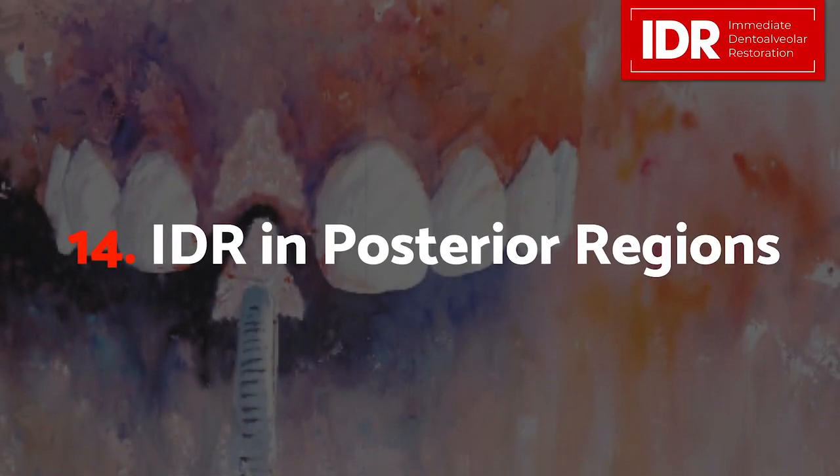Module 14, IDR in Posterior Regions. Here in this module, I will share with you the IDR application in the posterior zone. It's very important to pay attention now, especially to the care related to the occlusion adjustments.